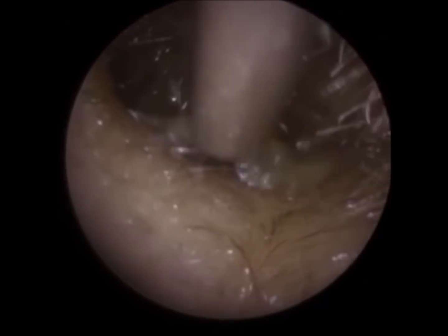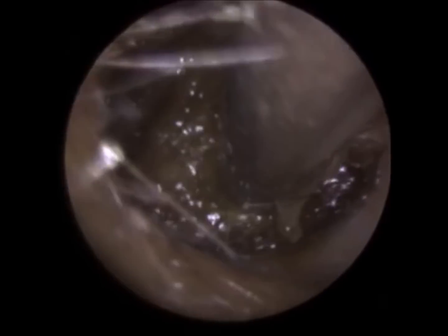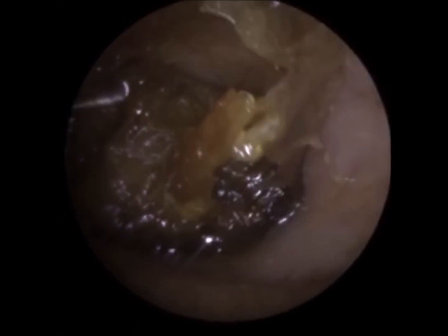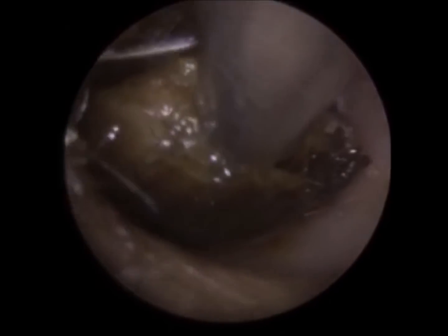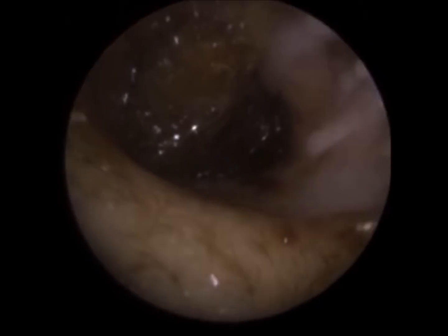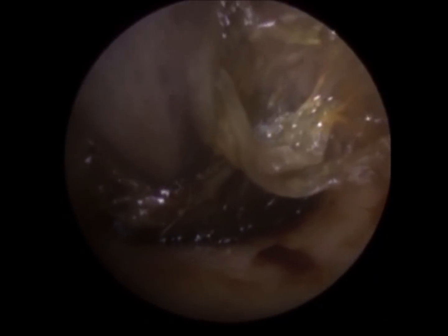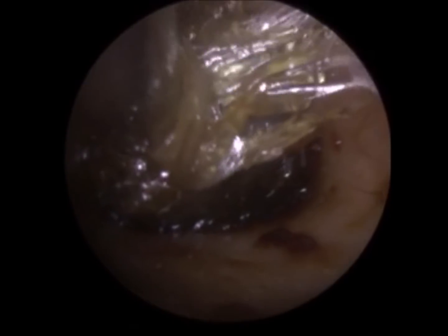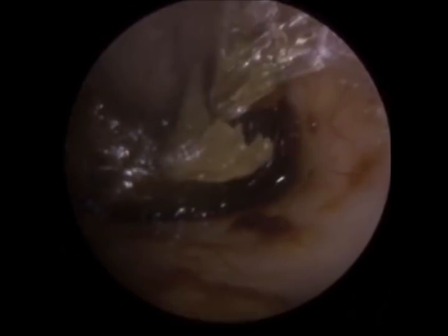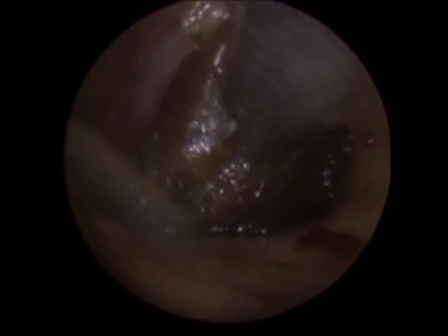For me, actually, it was quite satisfying performing the procedure on this ear because, although the patient attended almost completely deaf, the wax was so easy to remove. That was partly because the patient had been using olive oil drops. Olive oil drops tend to lubricate the ear canal wall, so as you're extracting the wax, it helps with the movement of the wax coming forwards. There's less friction. It can also soften the wax and give the ear practitioner a better suction grip.